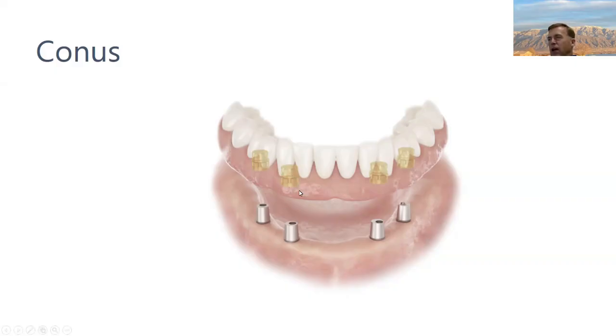When you press this down, the inferior border of this is warped slightly by the titanium. So when it's down, it's down. It doesn't move at all. It doesn't wiggle. It's nothing like a locator. It doesn't require a flange because it's entirely implant supported. And obviously the hygiene is still pretty good.